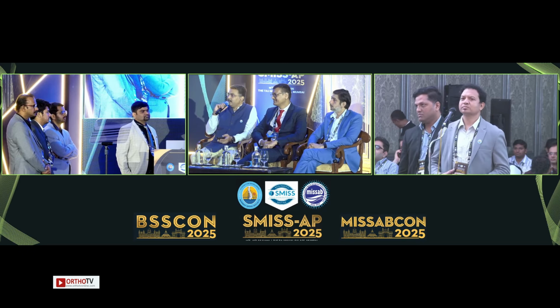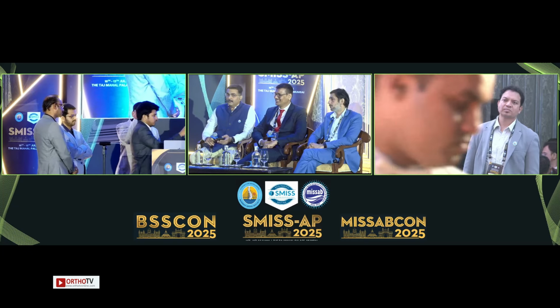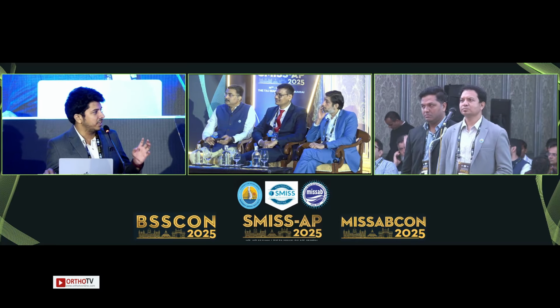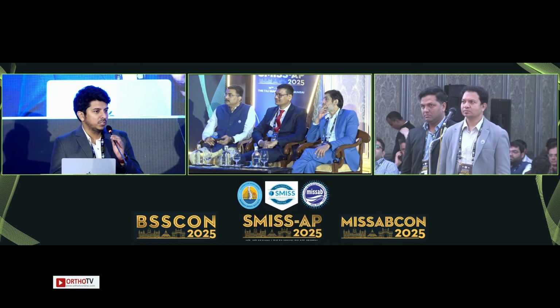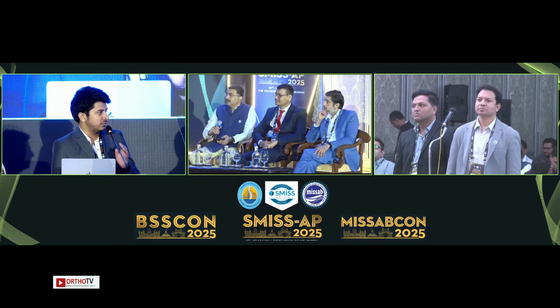Dr. Ravindranath, can you take the question? When do you combine two approaches? Using the algorithm, we first understand the pathology, where it is, and the dermatomal distribution. The decision on the approach has to be made preoperatively, because the choice of anesthesia also depends on it.